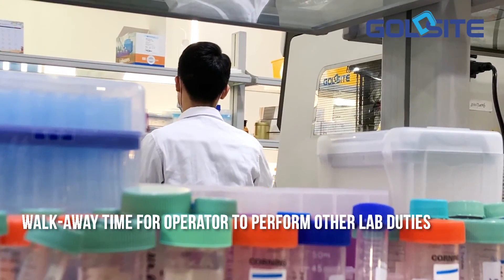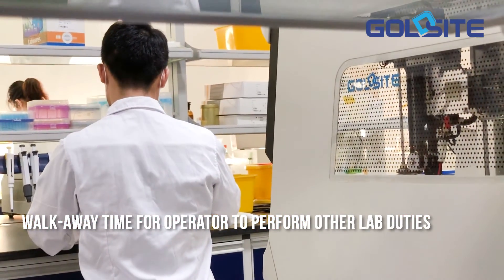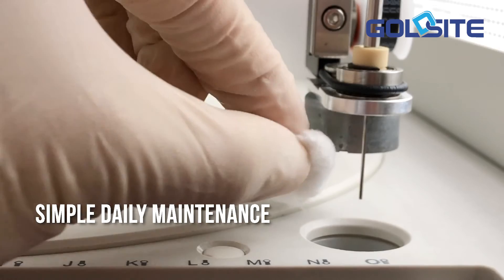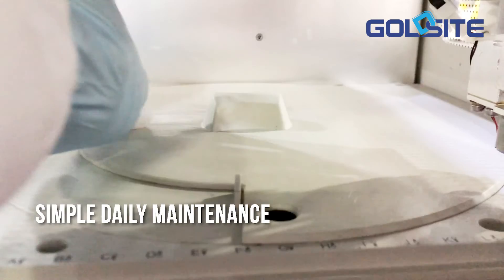The operator may benefit from walk-away time to perform other lab duties. Simple daily maintenance takes no more than 3 minutes — wipe the surface of the probe with gauze and 70% alcohol, then wipe the analysis panel.